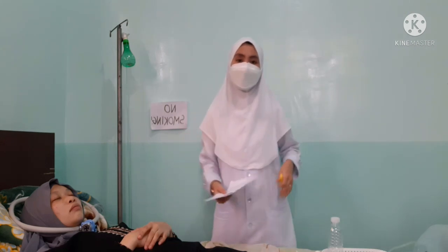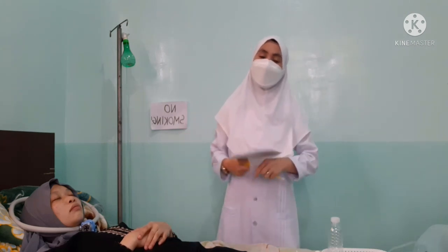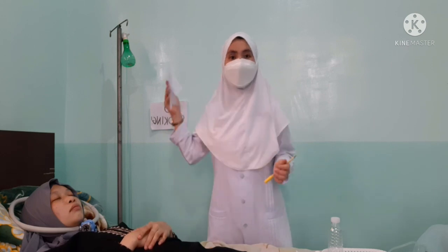And finally, we have to document the procedure done, the equipment that we used, the liters of oxygen per minute, and the cardiopulmonary status, and also the patient's response on the chart. And that will be all.